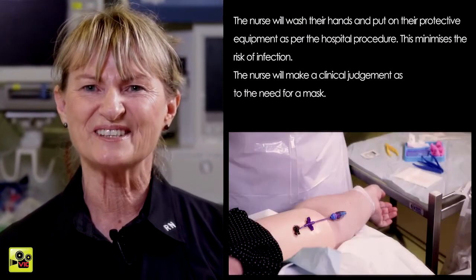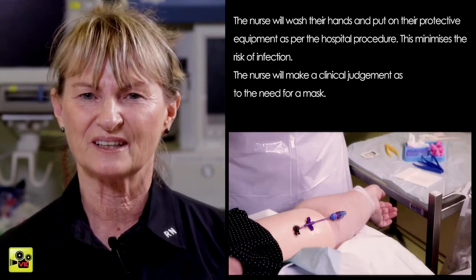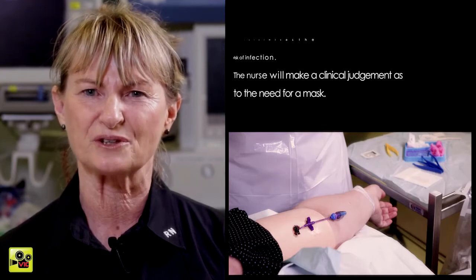The nurse washes her hands and dons her protective equipment. This minimises the risk of infection. The nurse will then make a clinical judgment as to whether it is necessary to wear a mask or not.